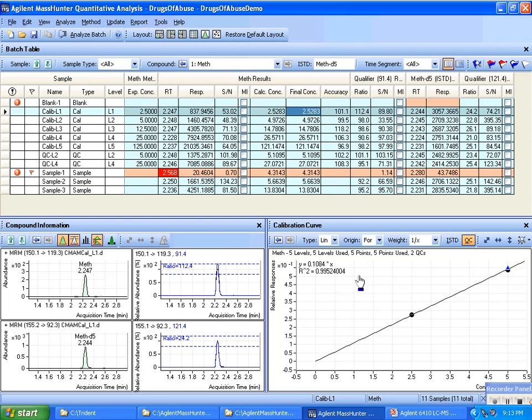So that is an example of the CurveFit and the CurveFit Assistant and its ability to help you manage your calibration, which is the centerpiece of quantitation.